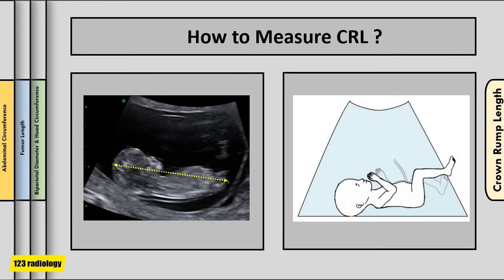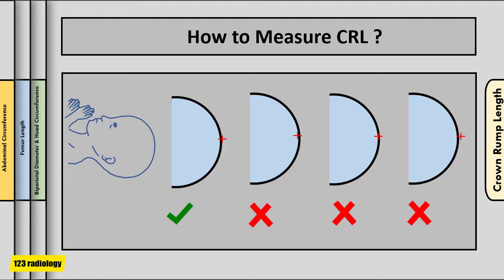To measure crown rump length, obtain a mid-sagittal section of the fetus. The fetus should be horizontal at 90 degrees to the angle of insonation, and in a neutral position — not hyperextended or flexed. The image should fill at least 30% of the monitor screen. Place the intersection of the calipers on the outer borders of the head and rump, and measure the maximum length from cranium to caudal rump as a straight line. Placing the calipers on the inner borders is incorrect and should be avoided.